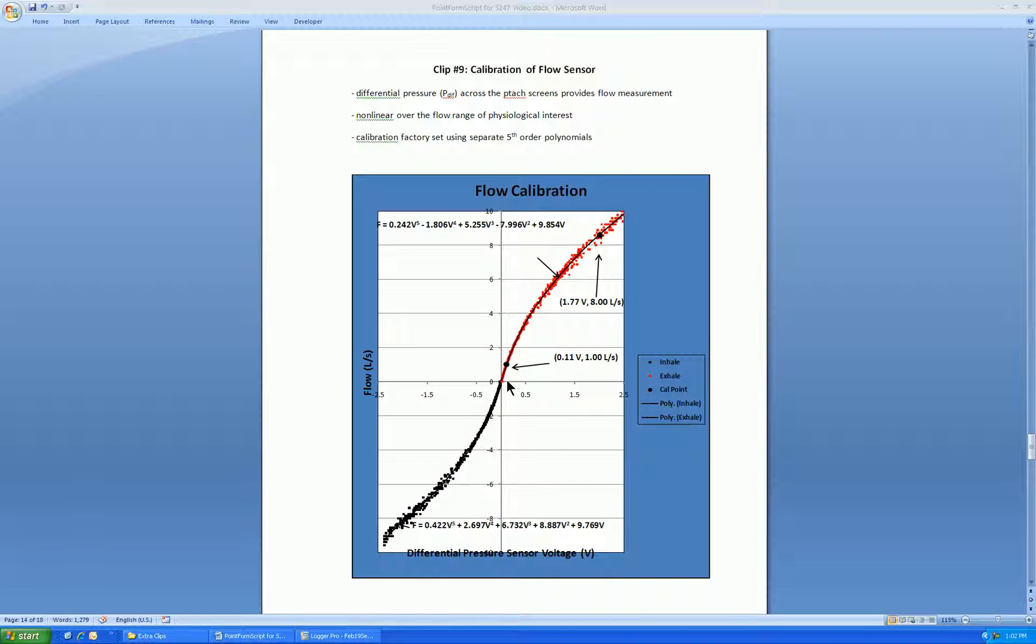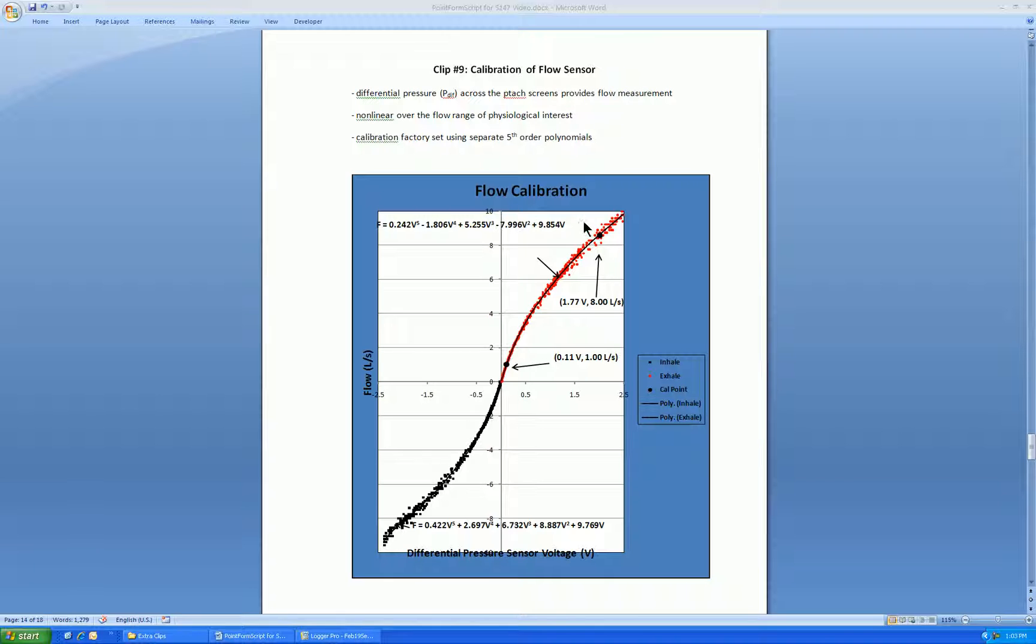The procedure of calibration is to calibrate at either of two points, thereby just shifting the calibration curve up or down. The lower point at about 1 Lps if you're interested in low flows, resting flows. The high point at 8 Lps if you're more interested in flow volume loops for lung studies, or even in exercise breathing in the range of 3, 4, 5 Lps.